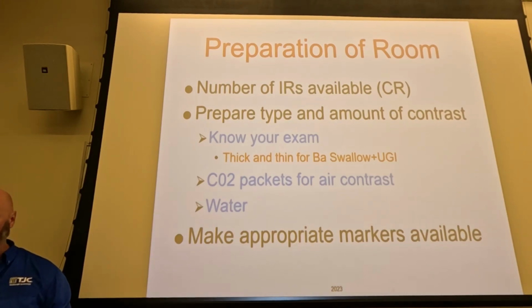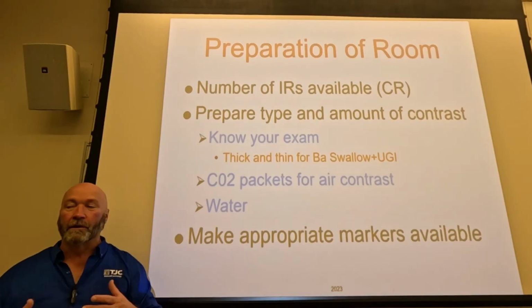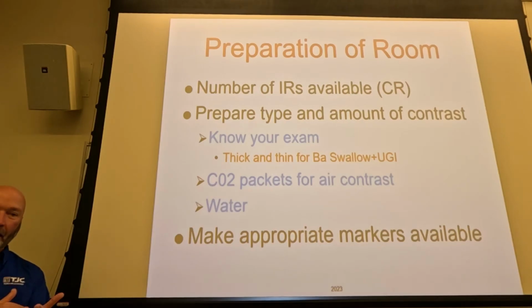Tell the patient to drink it right away, because sometimes the patient will look at it and want it to stop fizzing. Well, we need it to go down and fizz, because that introduces the air so that we get the air contrast. If we're doing air contrast, we're looking for the mucosal lining, okay? Air contrast, mucosal lining. All right, just lock those two together. Air contrast is always mucosal lining.